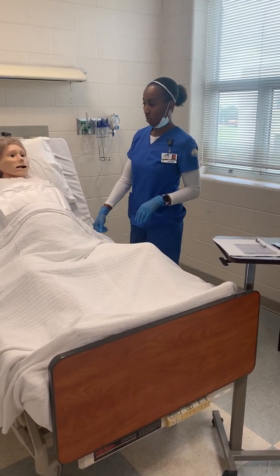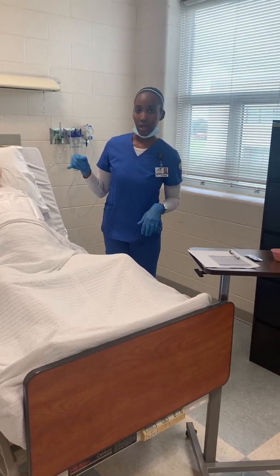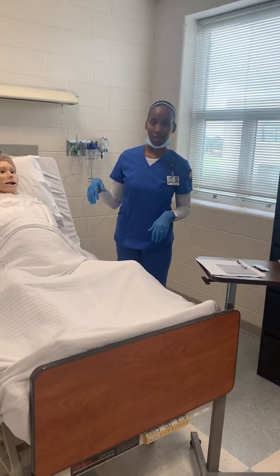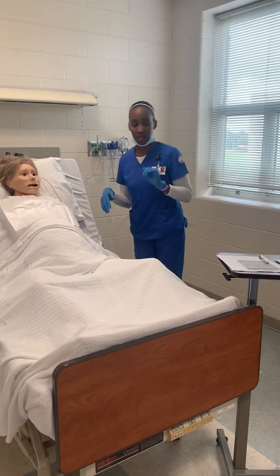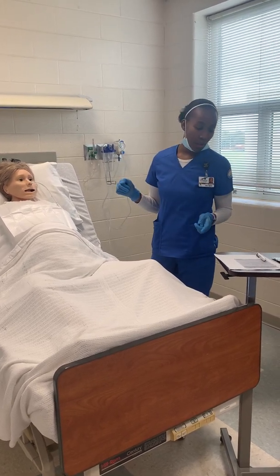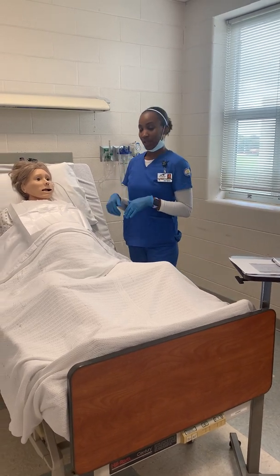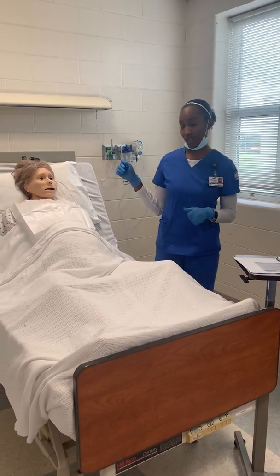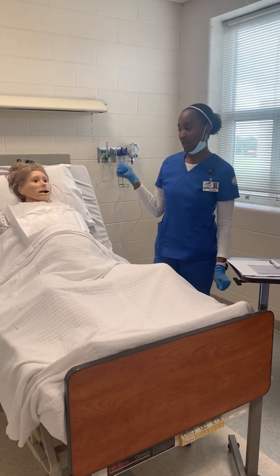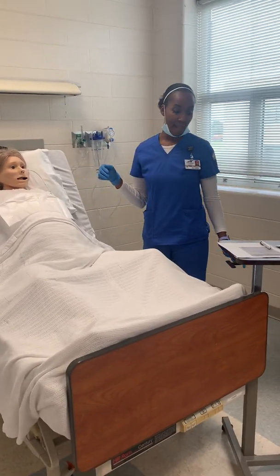Okay, and then I'm going to document which nare I put it in, how she tolerated the procedure, and all that. So now we have another order for gastric lavage. And before I start the lavage, I'm going to check for placement, either using the x-ray or pH test, according to whatever the facility says.